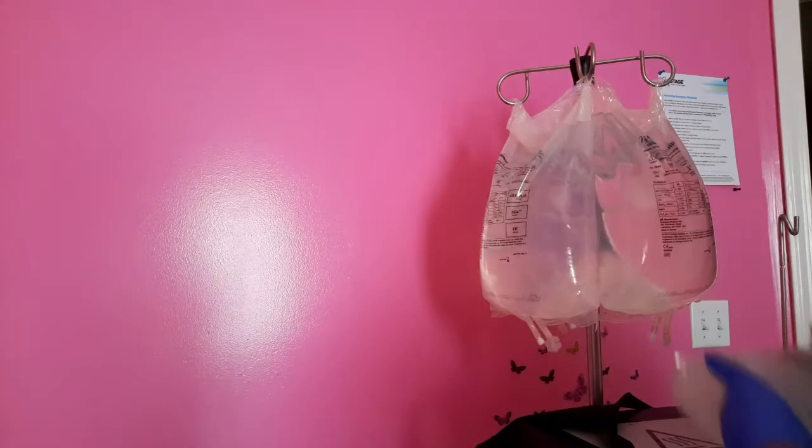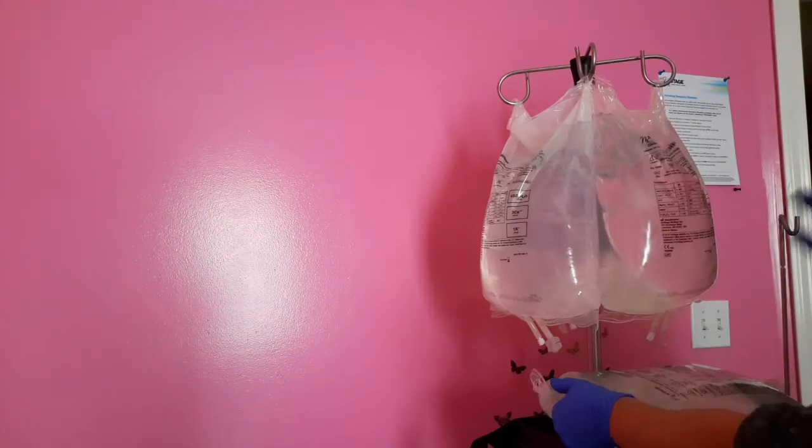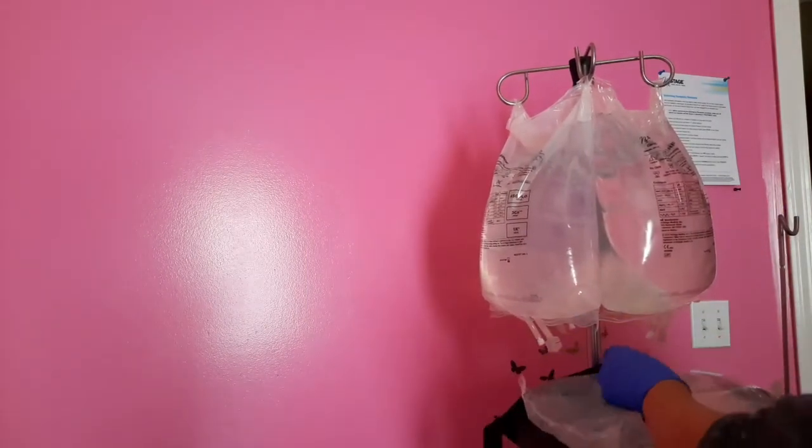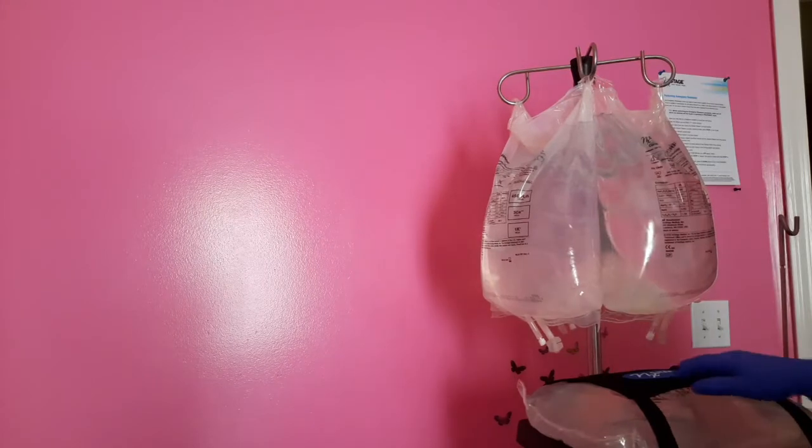And speaking of which, here's the one for the warmer. Here's the fourth bag. And again, the writing on top. Okay, facing the pole, because that's where you're going to hang your saline bag. So it makes sense to do it there. So we're going to put our bag in there, and we're going to strap this puppy in.